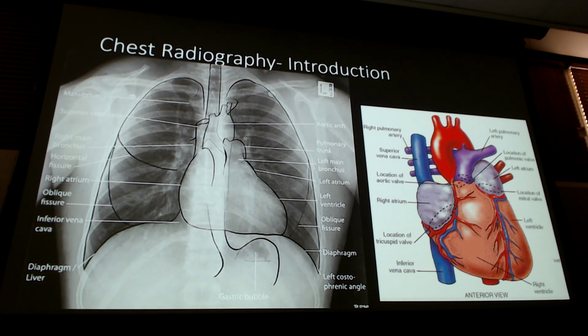It's because of the way the heart lies. And you'll see this on a CT image I'll show you in a little bit. The right ventricle is actually sitting directly behind the spine right here, which is why we can't see it. It's the way the heart lies. The heart is not this perfect left versus right. So this gray soft tissue bulge on this side of the spine is your right atrium.